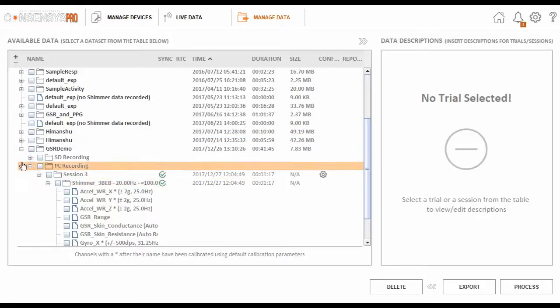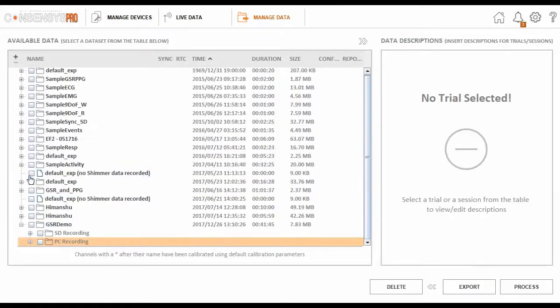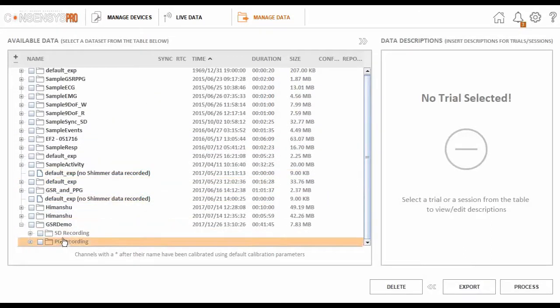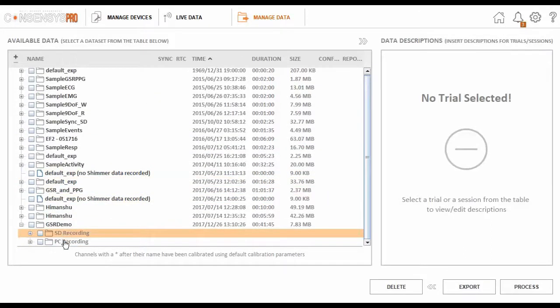So for the trial, GSR demo, I have two datasets. One, as we mentioned, with live PC recording, and the other with the data from the SD card.